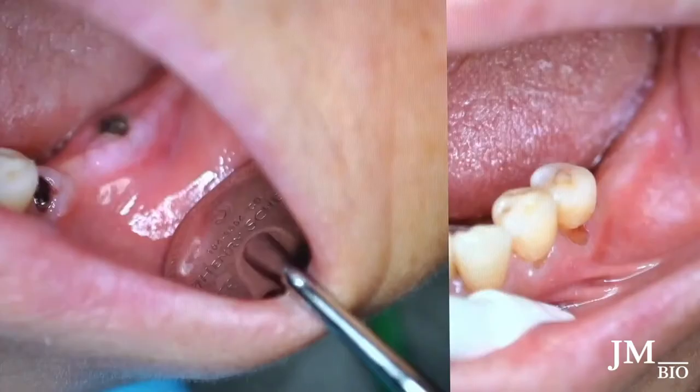Before to after, you see the difference in tissue. You can see the new mucogingival junction forming — it's getting lower. That's what you want: the vestibular depth to be deeper. When patients lose teeth, they lose vestibular depth too, and this helps to get that back.